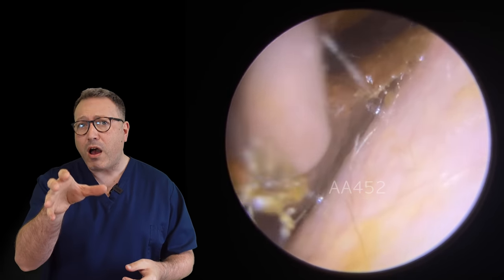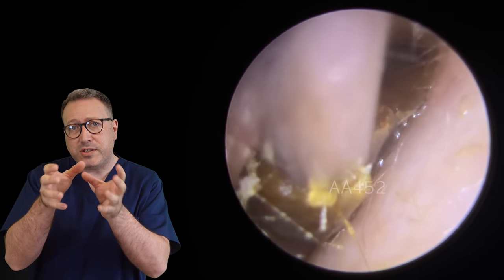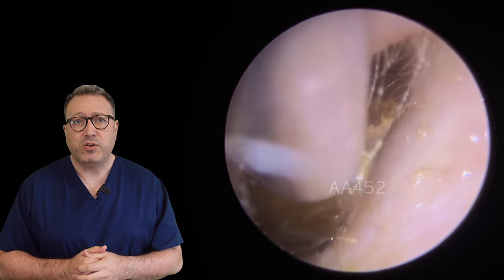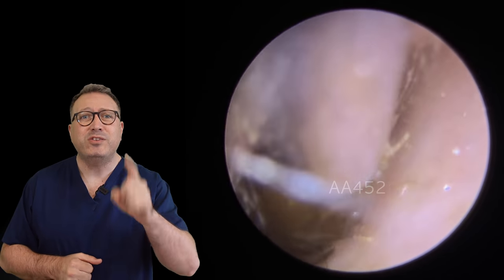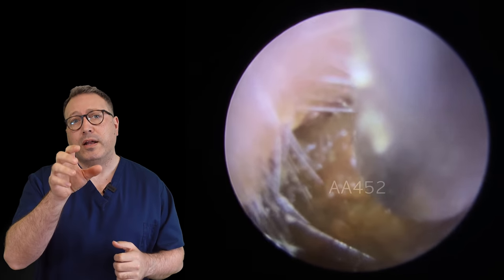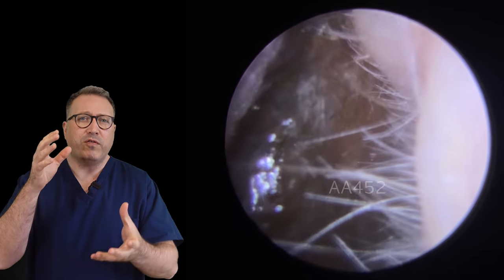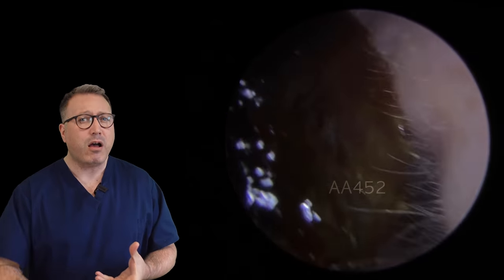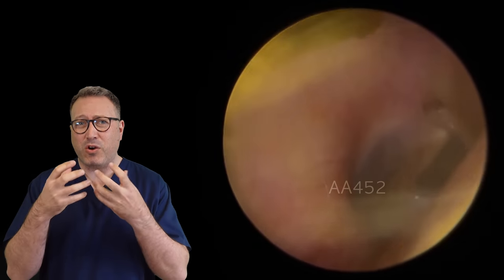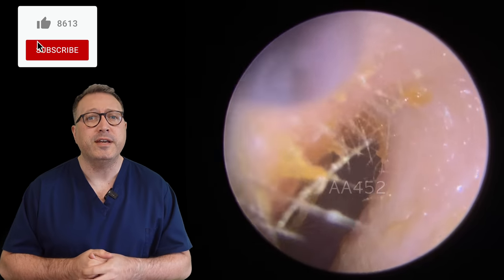You can see we've got this quite hard, flat piece here. In combination with the size and shape of the ear canal, we've got the standard size tube on the edge and we're just drawing this down the canal, trying to work it out. We've got a good grip on it — out it comes, quite a long flat piece. This is quite dark, and when earwax is dark it means it's old because it oxidizes with air, getting a much darker color the longer it's been in the ear canal.